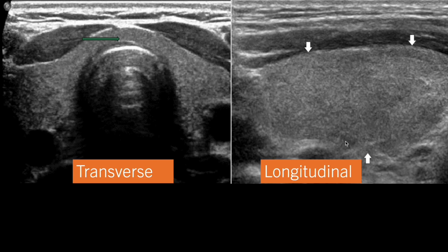This is the transverse view of the thyroid gland and this is the longitudinal view. The thyroid gland is made of two thyroid lobes connected by a midline isthmus. This is one thyroid lobe, this is another thyroid lobe, and they are connected by the isthmus, which is located in front of the trachea.